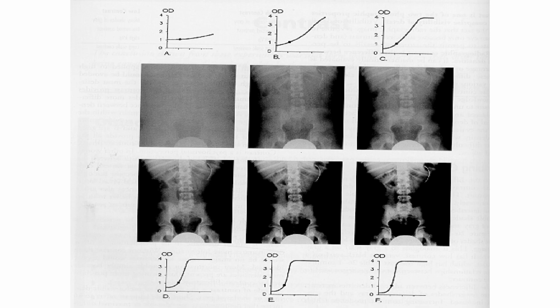So, yung dalawa sa inyo sabi, letter D. Okay. What can you see doon sa letter D? Okay, what can you see? You can see the lumbar, lumbosacral vertebrae.